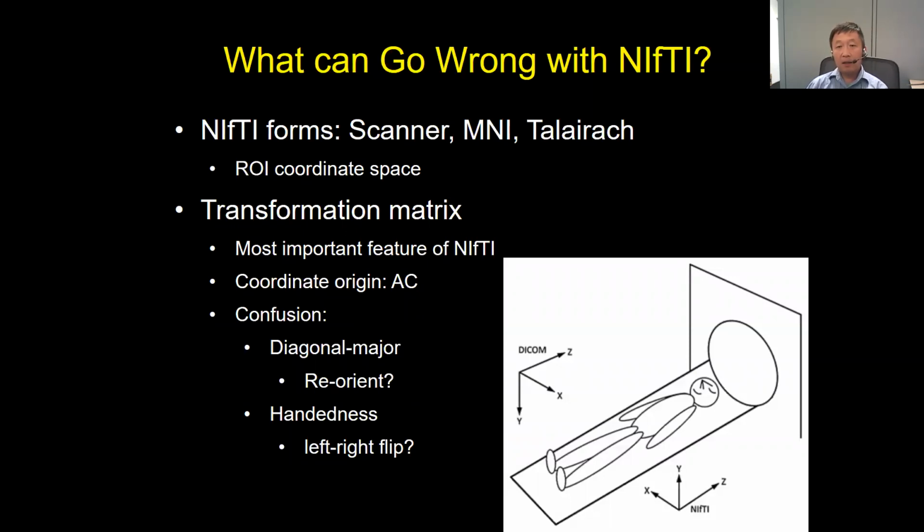So again, like the previous two seminars, I'm not going to go into great detail about NIfTI, what each header parameter means. If you are interested, it's very easy to do a Google search to understand those. What I'm emphasizing here is, while we all use image formats, what is easy to go wrong when we do some special analysis, and how can we avoid those errors in our analysis. That's what I'm going to emphasize.